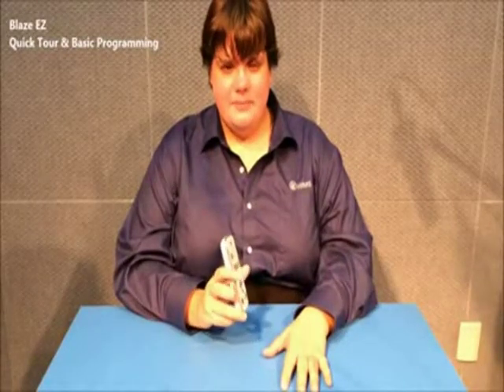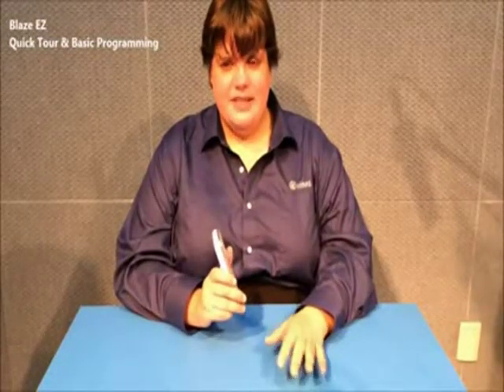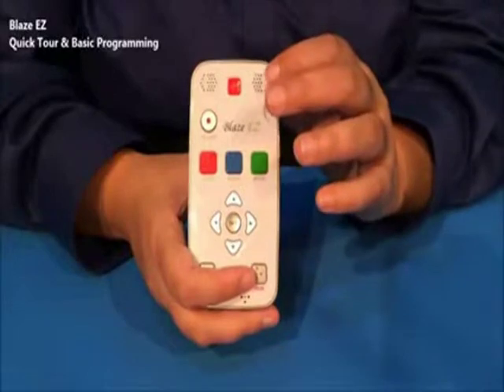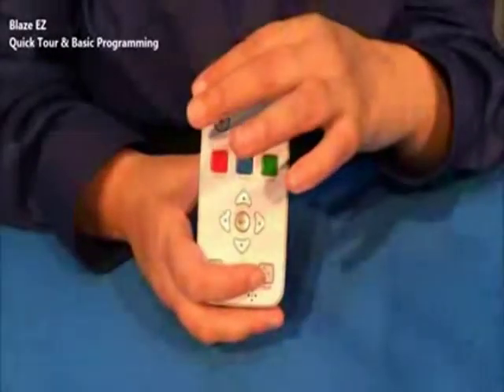So let's get started. We'll start by giving you a basic orientation of the unit, where all the buttons and ports are, etc. Basically a quick tour. At the top, on the left and the right, are the stereo speakers.